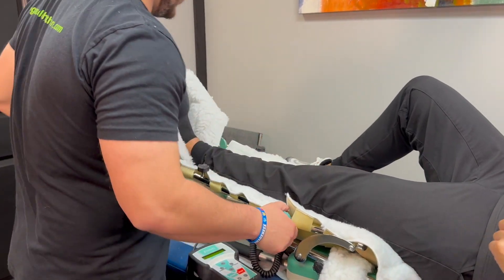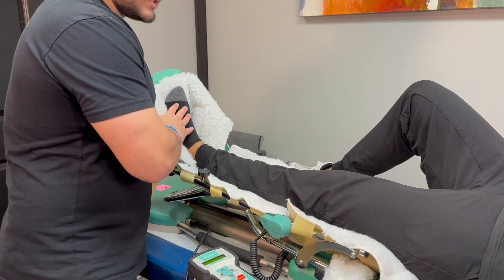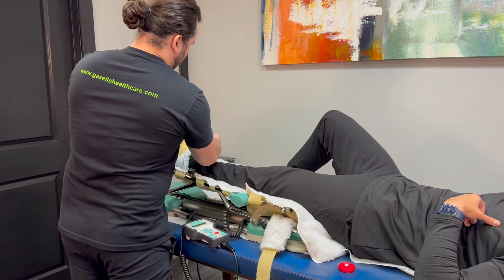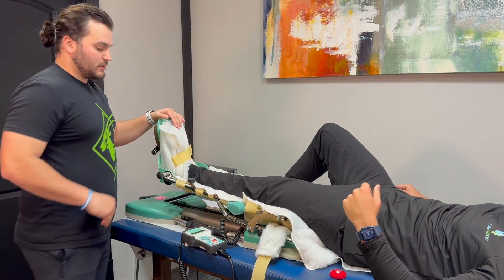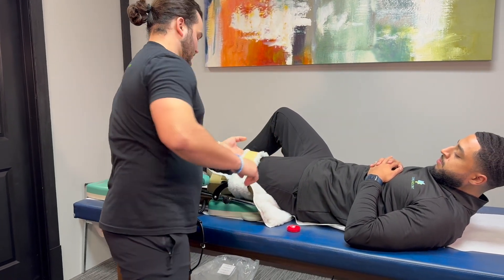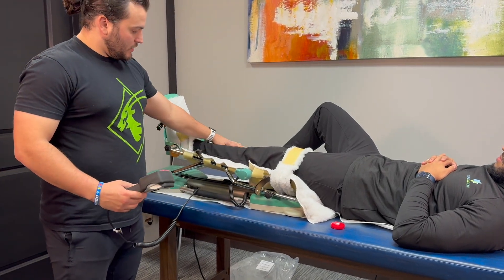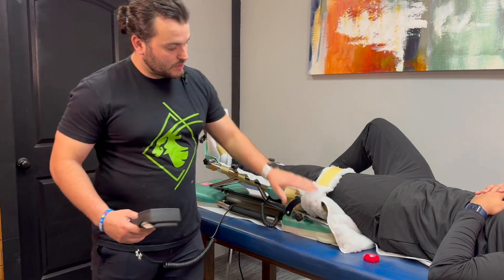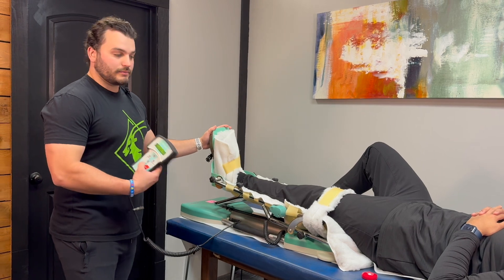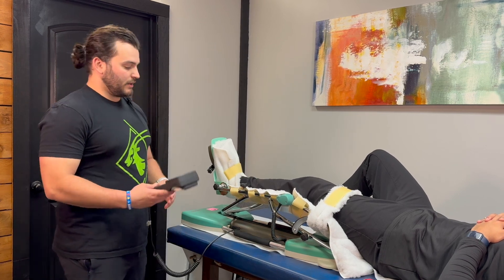Once he is pretty well centered, apply just a little pressure to the back of the foot part of the CPM to lock it in place. Go ahead and close the foot pad to have him nice and secure, then secure him with the back pad. As Austin is fitted in the machine, his leg being a little bit down is okay — it does come up pretty high on the patient, so that is totally normal. Then we just press start and he is good to go.